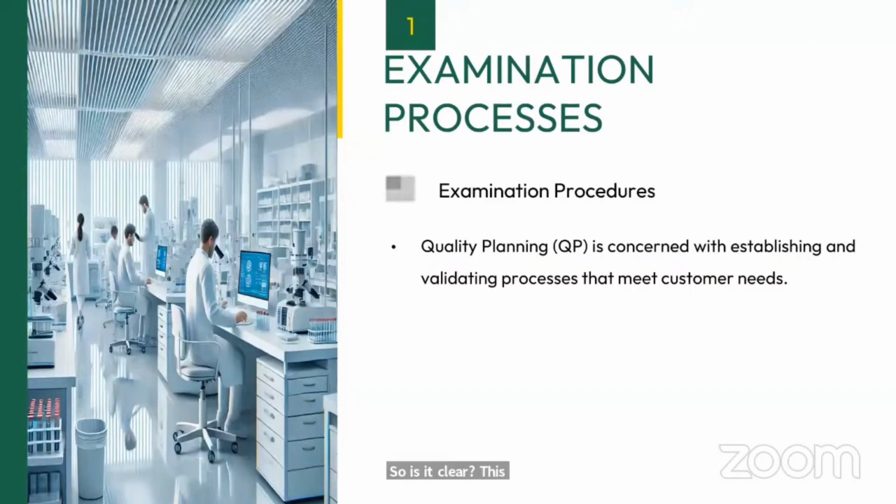So is it clear? This is the verification. Now when it comes to validation, previously I was performing the glucose estimation which is well validated. So when I was trying to use those examination methods in my laboratory, I will perform a verification. So that is verification.